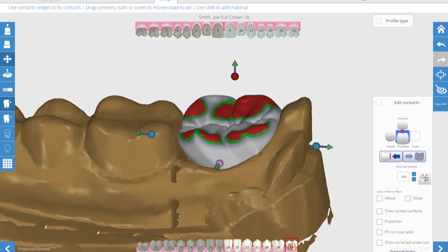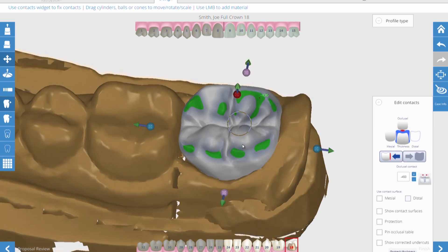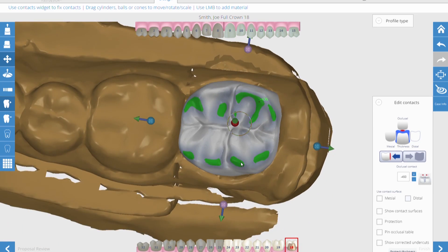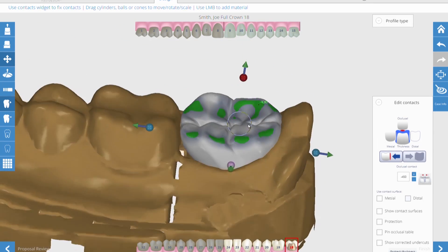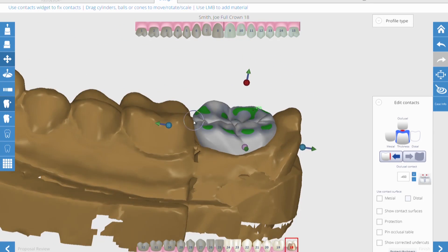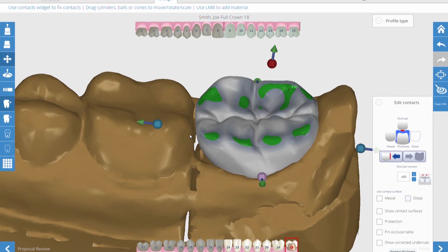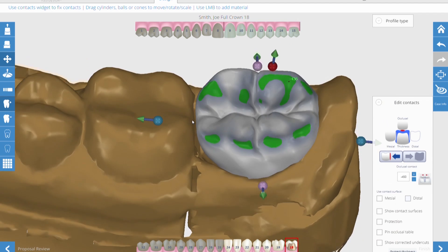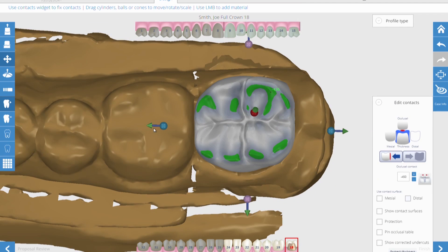You can set the occlusion so it's in contact with the opposing tooth, or you can set the occlusion so that it's slightly out of contact with the opposing tooth, just in case your assistant's temporary isn't as accurate as it should be.